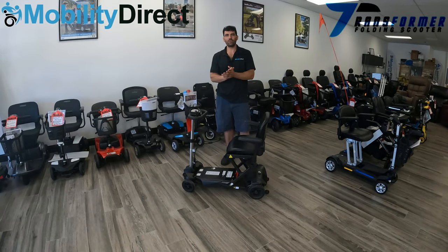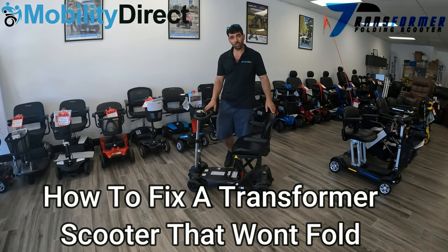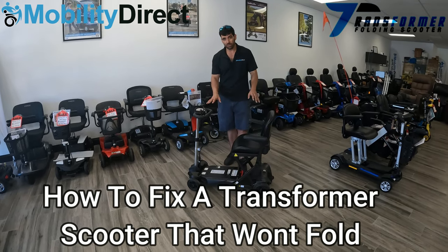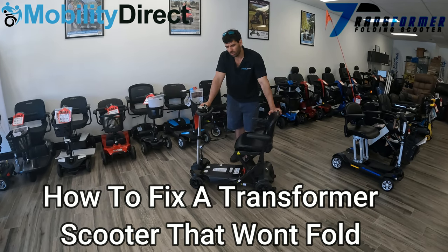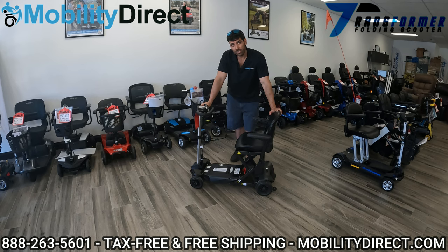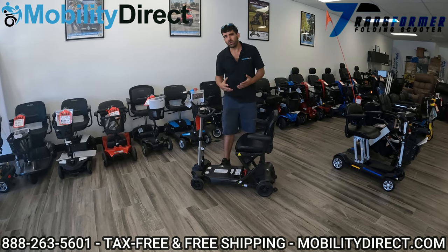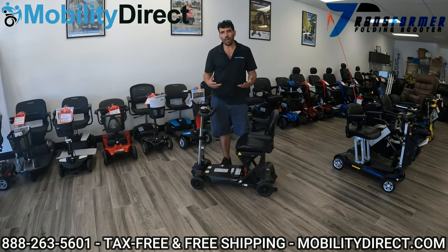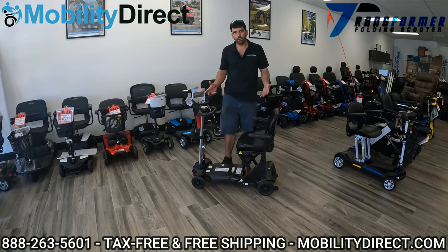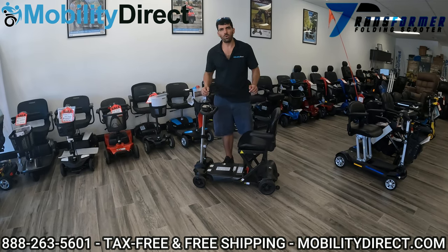Hi everybody, I'm Sergio with Mobility Direct and thank you for joining us in today's video. I'm going to show you a couple of things about the Transformer Automatic Folding Scooter that might help you. We have a lot of customers that own this scooter and they sometimes call us and say they don't know what's going on — it's not folding or unfolding. You can hear the motor moving, but it's just not moving.